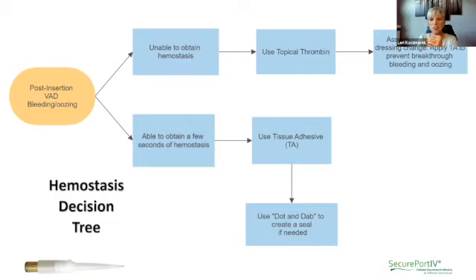Okay, that's what I was trying to figure out. Yeah, it tends to tack on there as glue, things stick to glue. But be aware too, first of all, I want to make sure you have the hemostasis before you put that on, before it all goes on there. But if you need to release that disc, just soak it with your CHG that you're prepping with at that dressing change, and that should lift off. It shouldn't be that much of a stick or tack unless you're wrapping or turning that disc around somehow. Should not, but I would love to speak with you offline if that's continuing to be an issue.